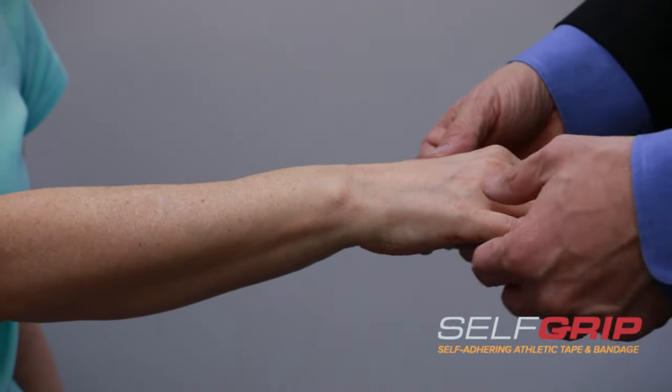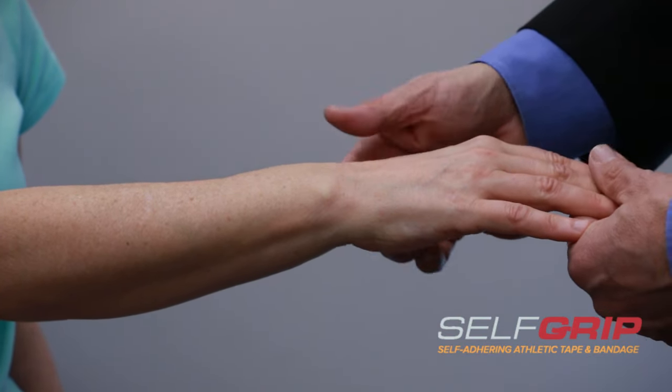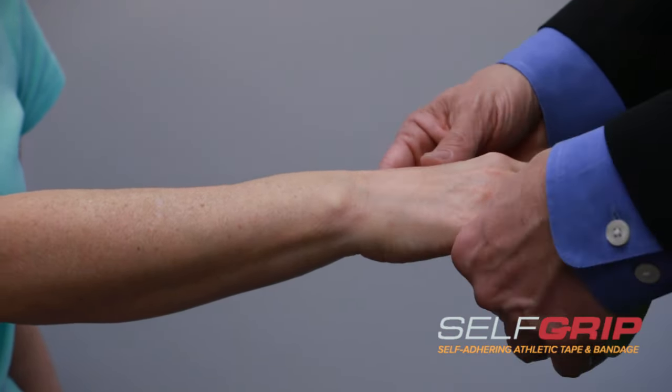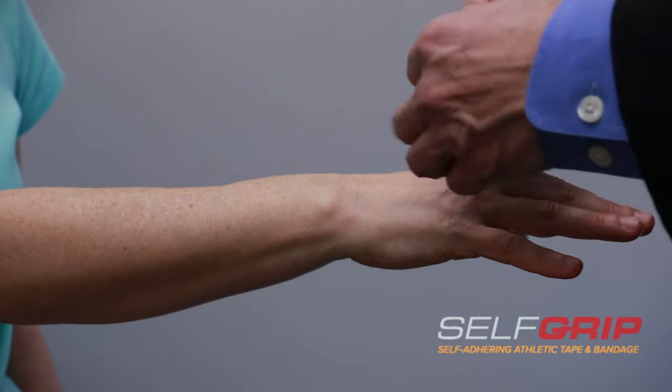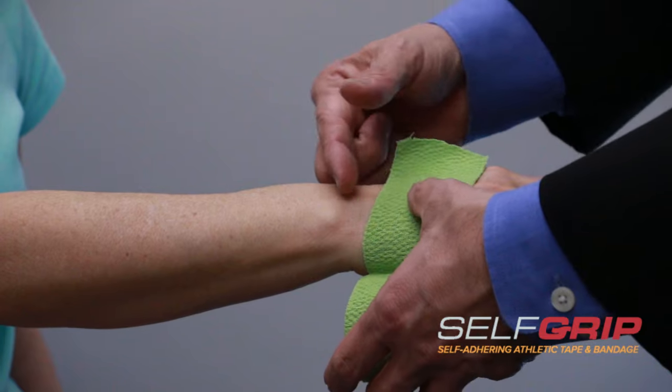So our tape's job is to support an injured area and reduce the direction in which the injury occurred. So we're going to start with a spot down on the hand and then tape upwards.